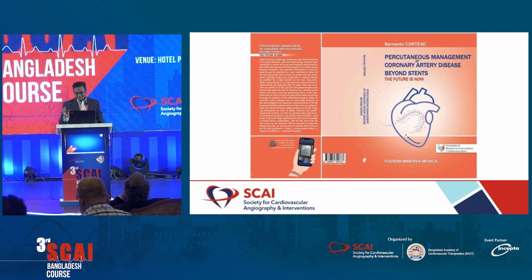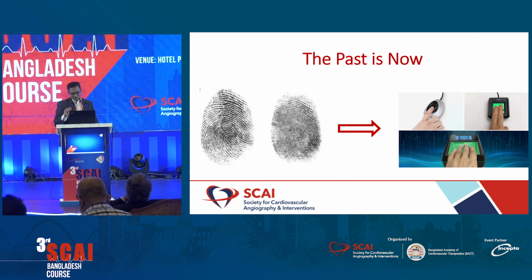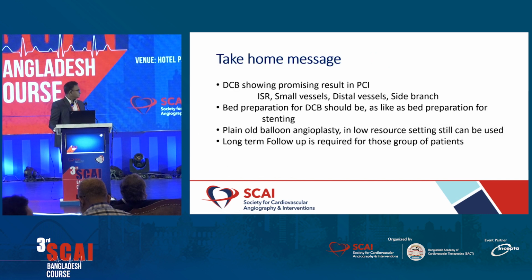Yes, you rightly mentioned, to see the plaque burden we can do imaging like IVUS or OCT that might give a good result. But as there is a distal lesion, a narrow vessel, less than 2 millimeter, we just did the balloon angioplasty. LAD, whatever the size, 2.5 millimeter, LAD matters anyway. LAD we never call a narrow vessel. LAD is always the mother vessel. A lot of branches they usually provide, a lot of myocardium they supply.